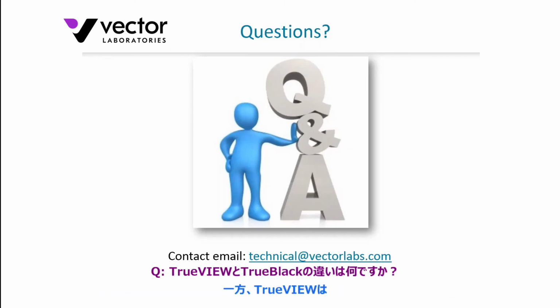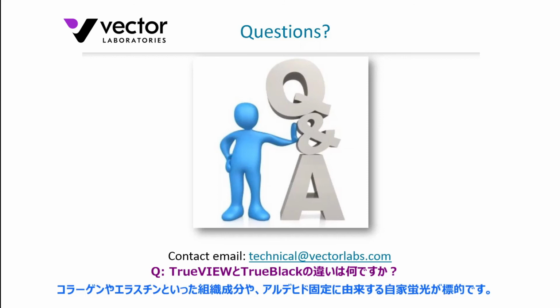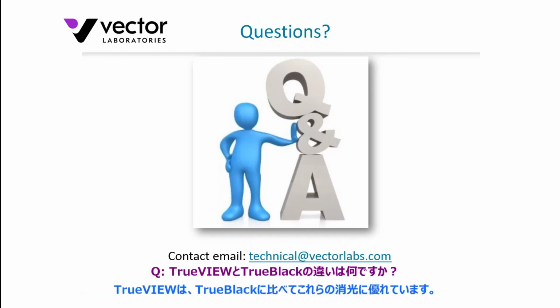TrueView, on the other hand, does target those cellular elements, the fluorescent proteins we mentioned, collagens, elastins, and autofluorescence induced through use of an aldehyde fixative. And TrueView is superior in quenching those compared to TrueBlack. But I will say TrueBlack is superior in quenching lipofuscin over TrueView.